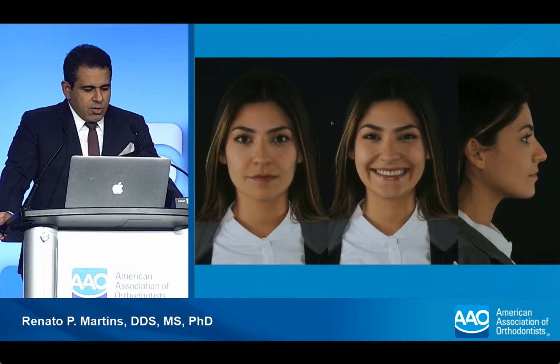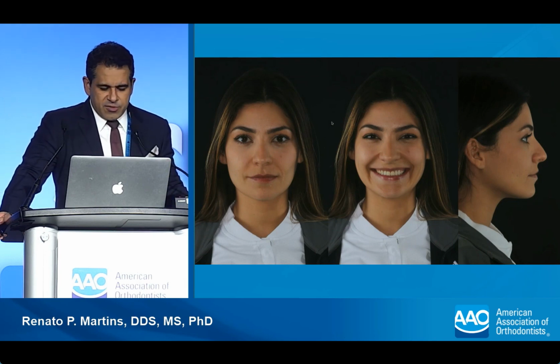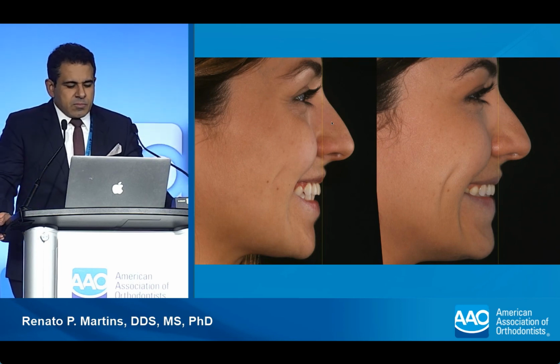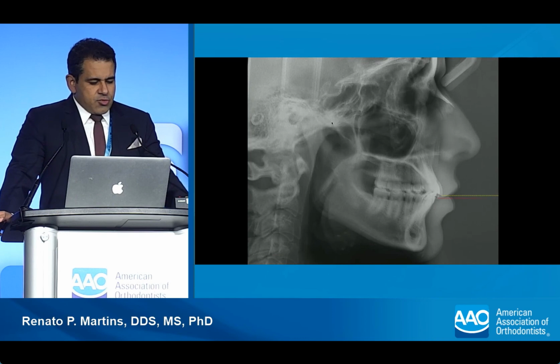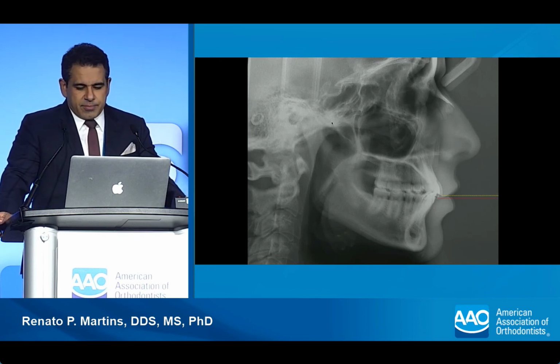So here's the result before she went to do the finishing cosmetic on her incisors. This is what we got retracting them. So her incisor is parallel with the face. And we can check the extrusion that we get, relative extrusion of the incisal edge.